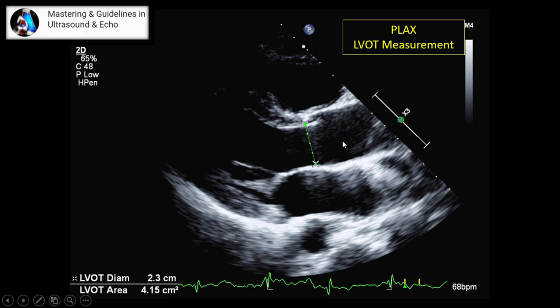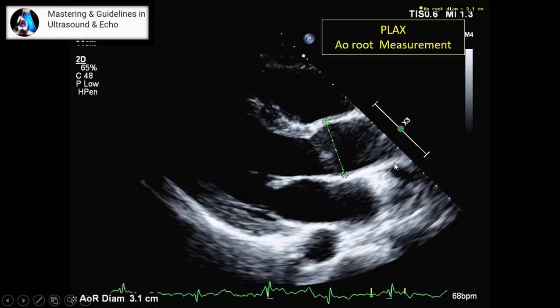And we have to try, especially when we have aortic valve stenosis calcification, we have to do this measurement two or three times in different angles, a little off axis. Slide or move your probe a little higher or lower intercostal, and see which one will give you the best and highest diameter. Then take that one as the LVOT diameter and delete the other measurements.